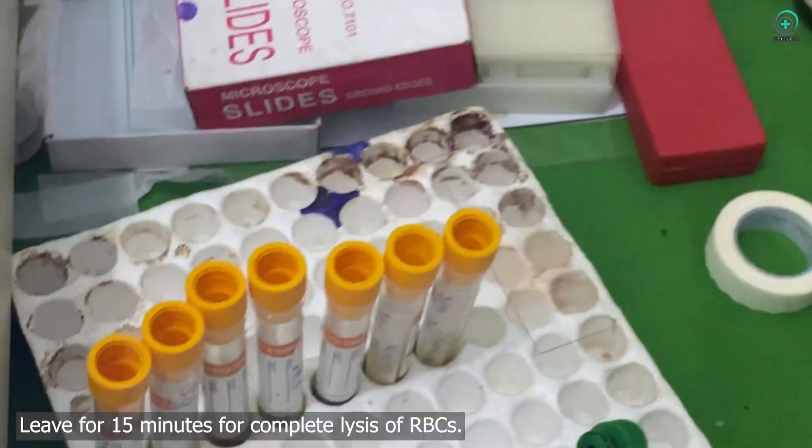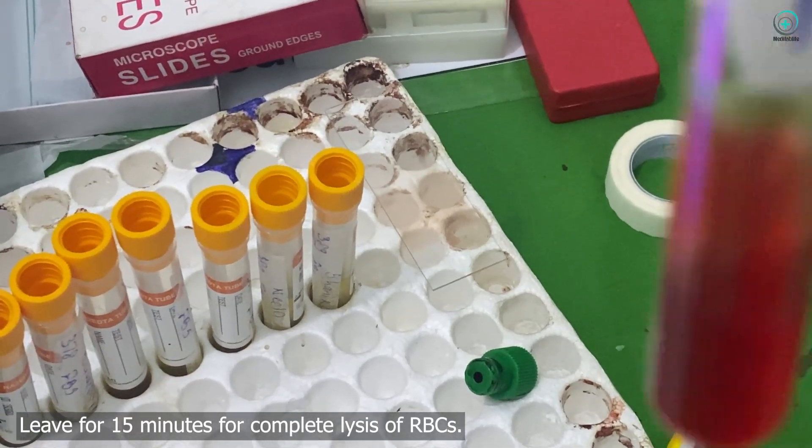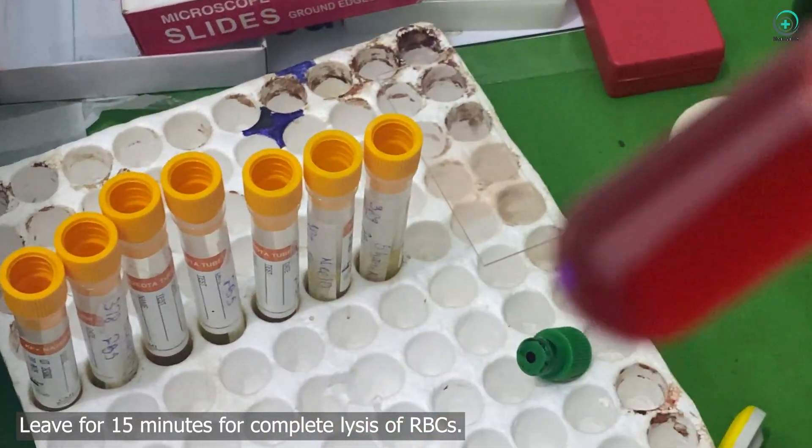Step 3: Waiting for lysis. Now, we let the sample sit for 15 minutes to ensure complete lysis of the red blood cells.